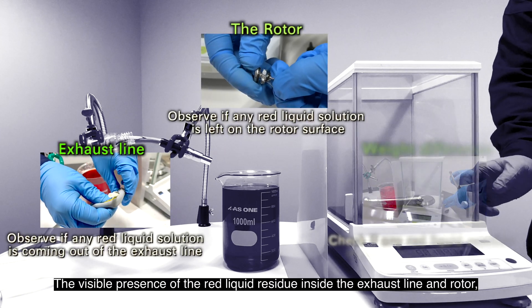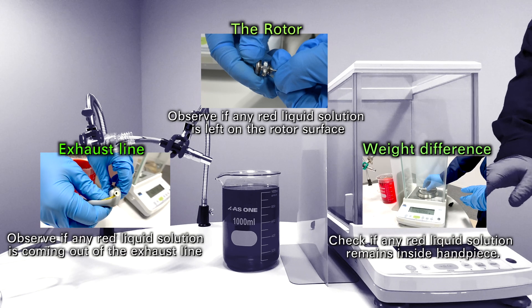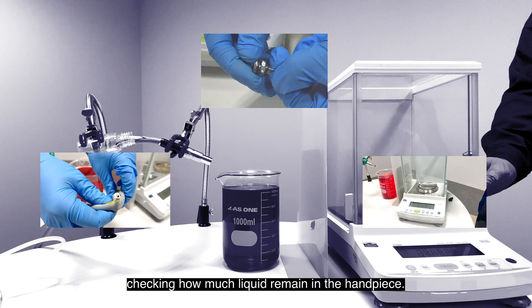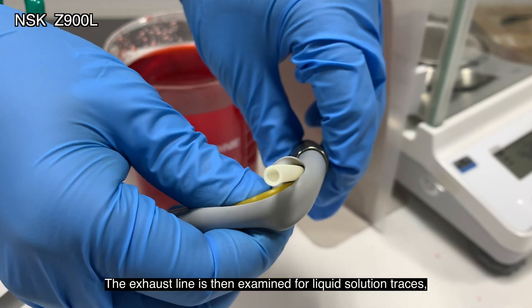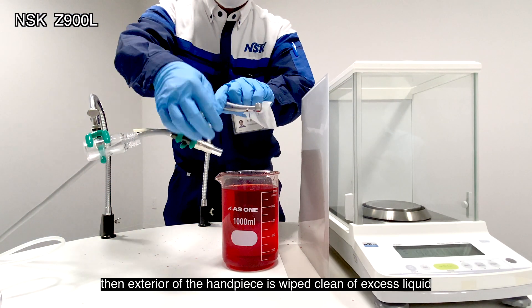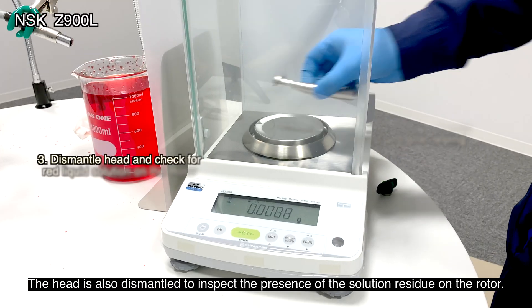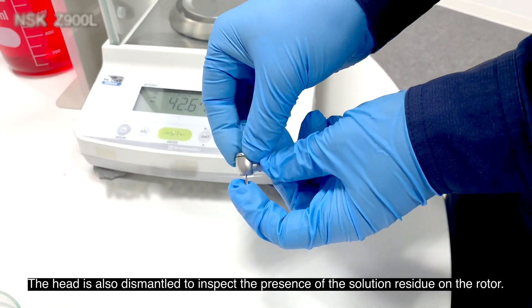The visible presence of the red liquid residue inside the exhaust line and rotor is noted, as well as the weight differences before and after the operation, checking how much liquid remains in the handpiece. The exhaust line is then examined for liquid solution traces, the exterior of the handpiece is wiped clean of excess liquid and weighed again, and the head is dismantled to inspect the presence of the solution residue on the rotor.